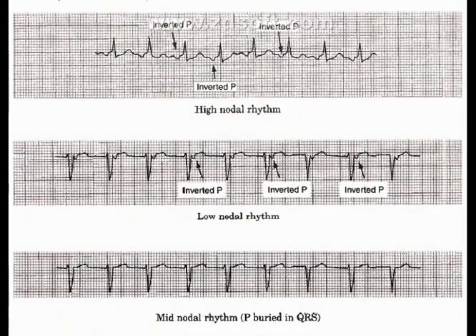Here is the ECG of high nodal rhythm. The above ECG shows high nodal rhythm with an inverted P wave. The middle ECG shows low nodal rhythm — there is an inverted P wave after the QRS complex. The last ECG shows mid nodal rhythm — there is a P wave buried in the QRS complex.